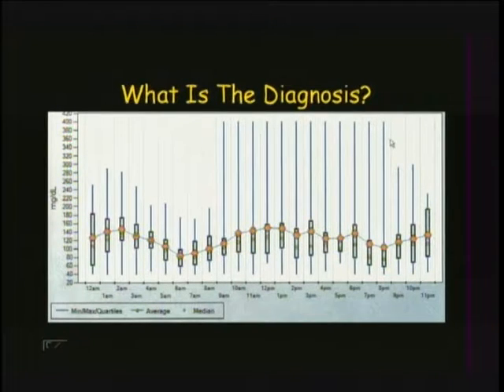This is 1 dose of acetaminophen, Tylenol. Remember the hydrogen peroxide business? You can't take acetaminophen with this device because the hydrogen peroxide, from the metabolism of the acetaminophen, is interpreted as glucose, and it goes off the chart.